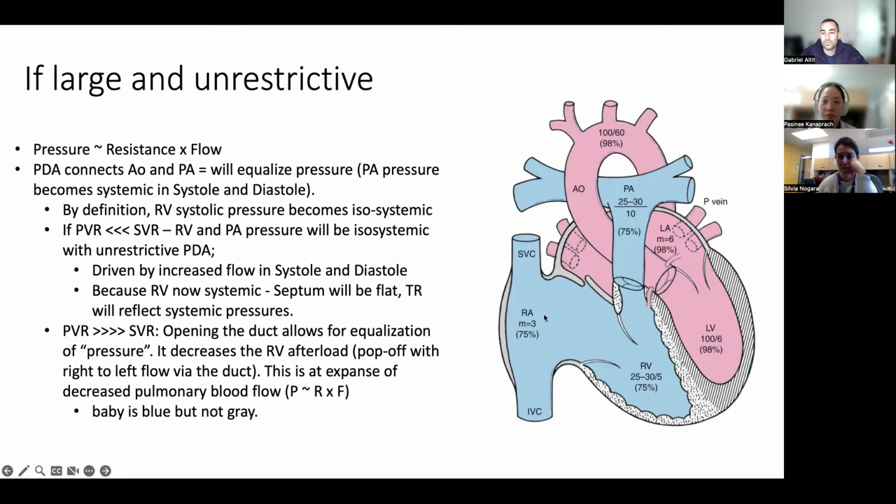So this is the central venous saturation, and this is what we call the central venous pressure. And this pressure will start rising if you have, for example, an obstruction at this area, or an RV that's having difficulty, like think about right ventricular failure or diastolic failure. If you have a tamponade, for example, you're going to have an increase in your right atrial pressure because the right atrium is not able to empty into the right ventricle.